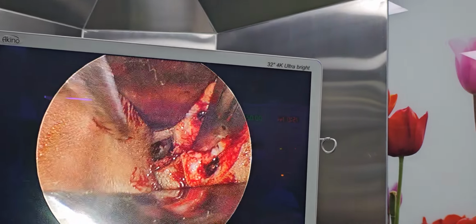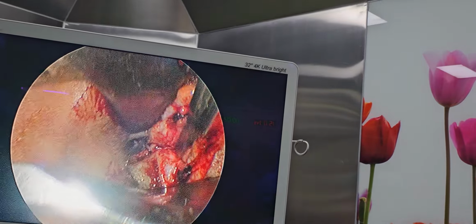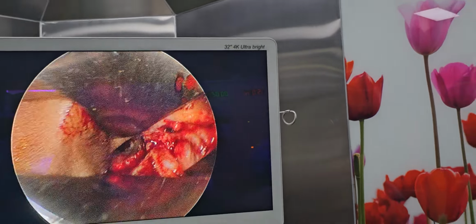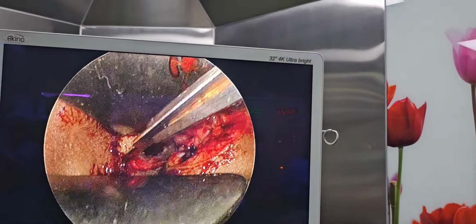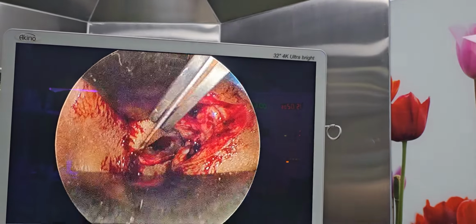On the bone, I am on the bone, and then I am going back on the mastoid. I am feeling the periosteal incision. See this? Now, fourth is this modification because you have to clear the flap, come out.